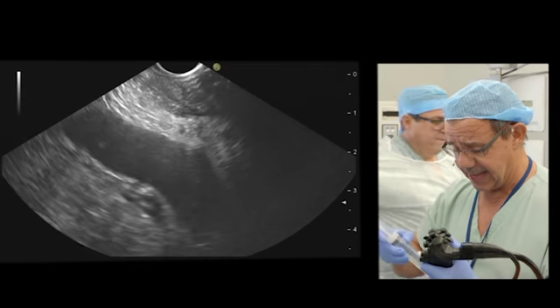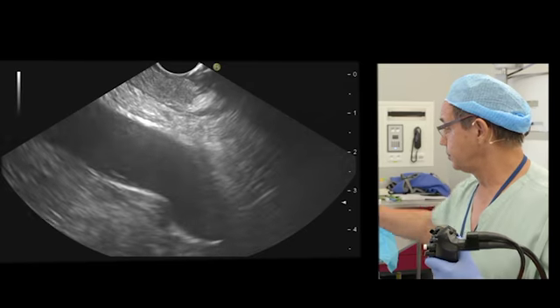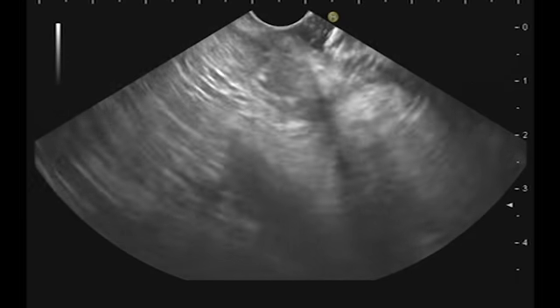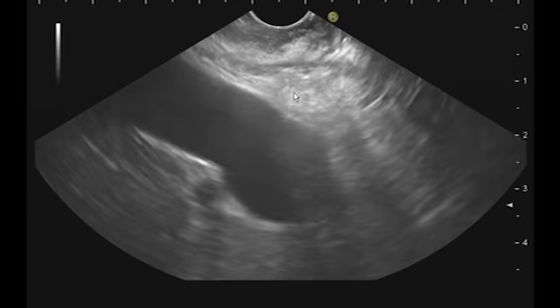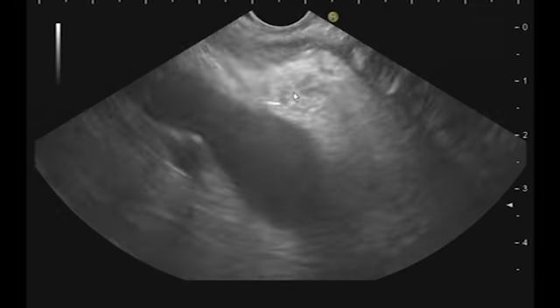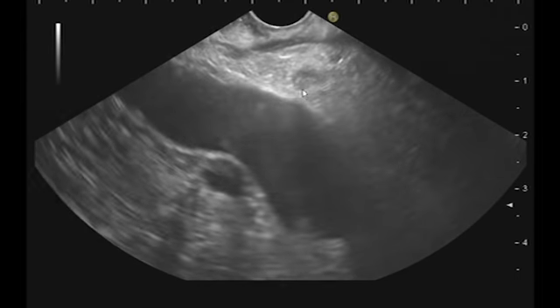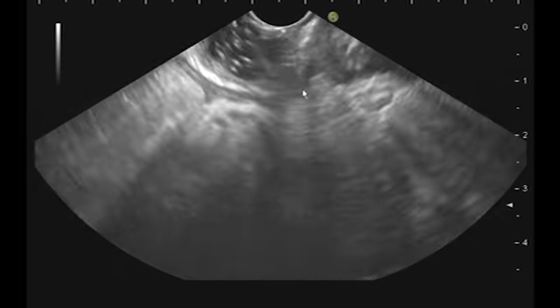Okay, now I will put some water inside the duodenum. And here you see again the lesion here. This is the lesion, and this lesion is an invasive lesion. Here again. And there is a small node. Try to show you. Here, there is probably a small node. Okay, this is the pylorus.